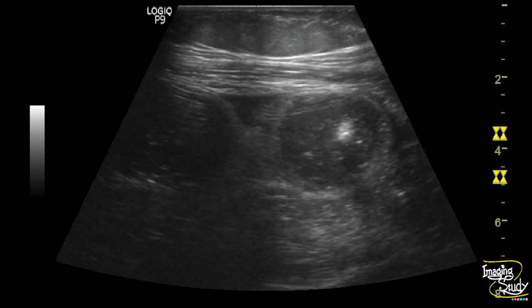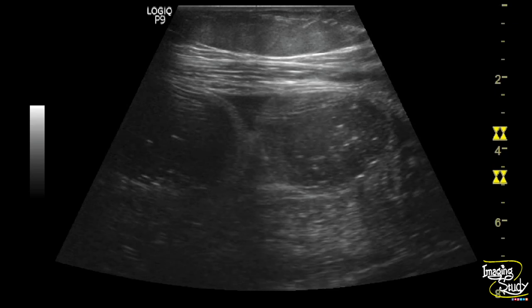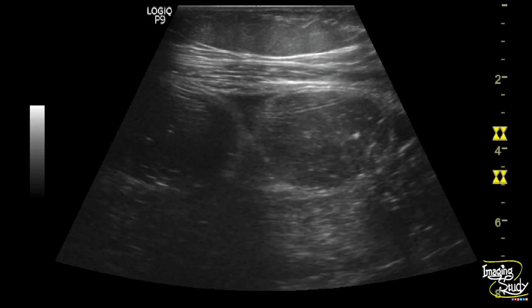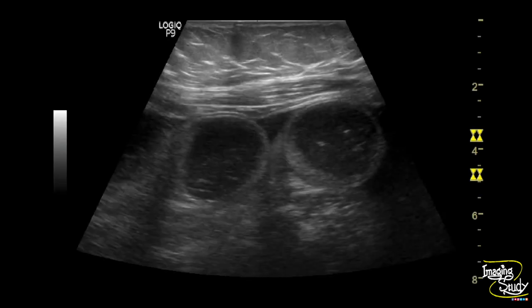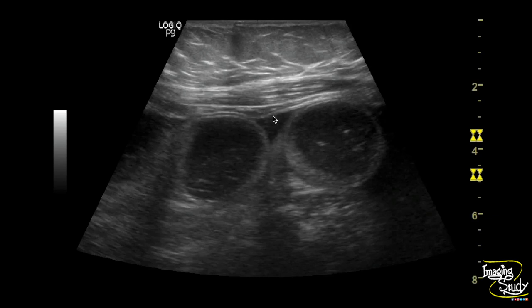These are part of the small intestine. Here is the picture of the distended small intestinal bowel loops. You can see the wall shows the presence of gut signature with layered hyper and hypoechogenic lines. This is the triangular fluid between the bowel loops, which is commonly known as tanga sign.